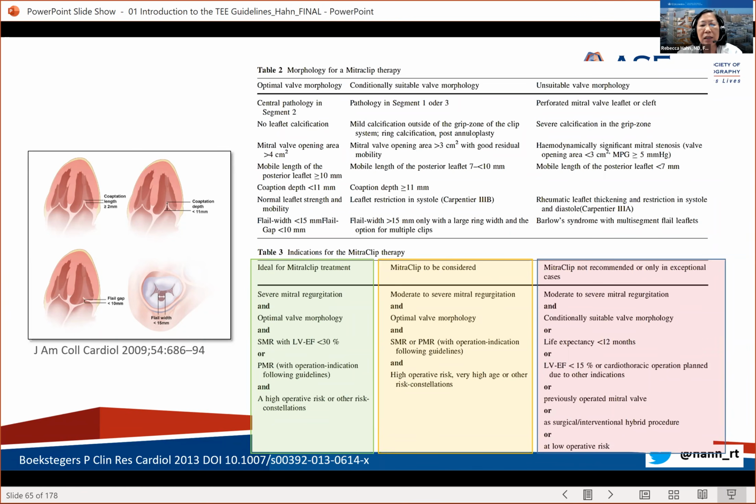The only time that we tend to be called up to the OR is when there's a discordance between the pre-procedural imaging and the operating room images. And you have to be really, really, really careful there, because obviously the patients are under general anesthesia. And that's when we'll start to ask for some hemodynamic loads, to mimic the loading condition in an awake state in order to more accurately assess the regurgitation.